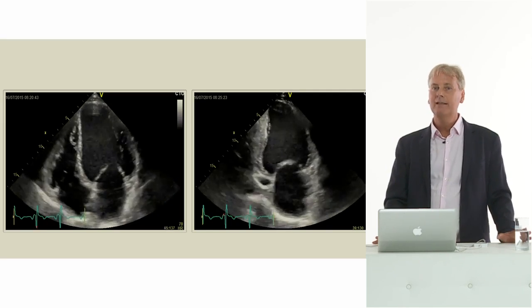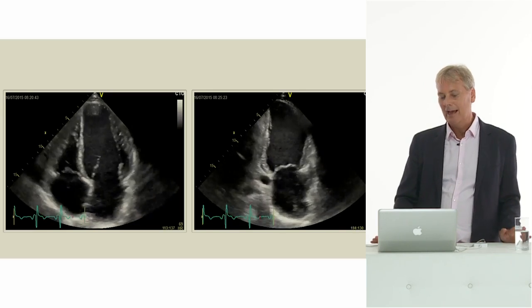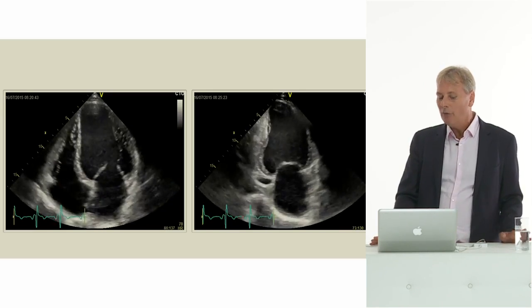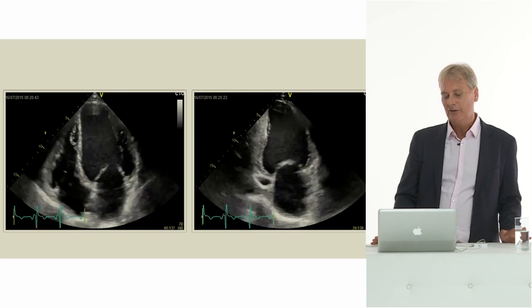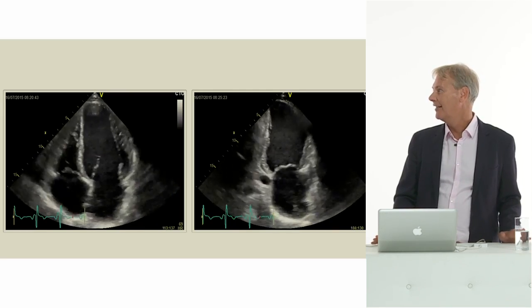And the guy was really symptomatic. You know, he had rales over the lungs, so it was clear that he had dyspnea. And now we're going to assess diastolic dysfunction and look at his filling pressures. Martin, do you think he has elevated filling pressures? I'm pretty sure. Everything else would be surprising. Yeah. So maybe you don't need anything to know that. Yeah, I think that's just one of these examples which show us that you have to put everything into perspective.